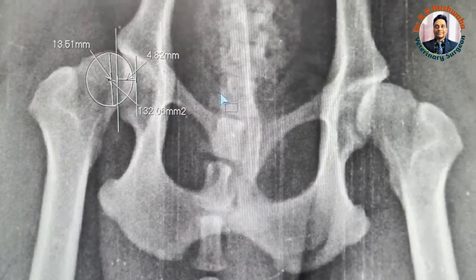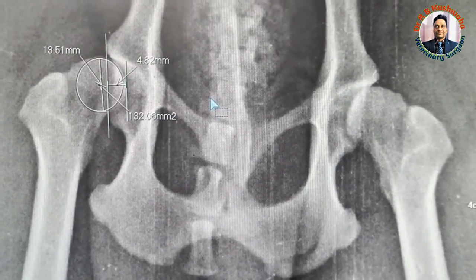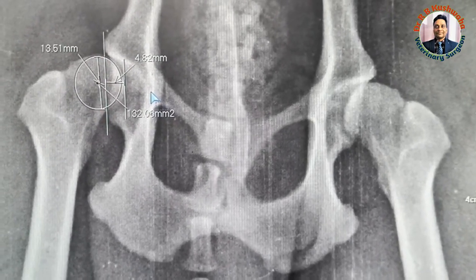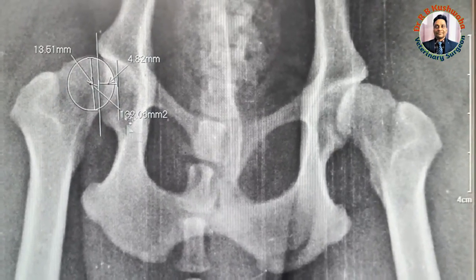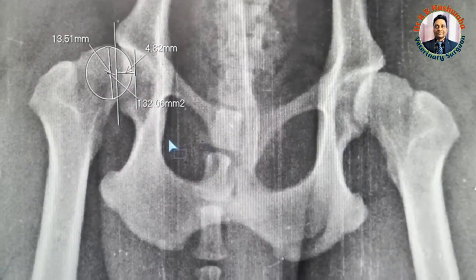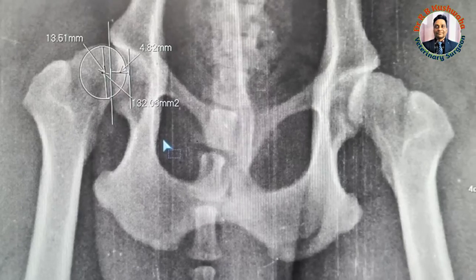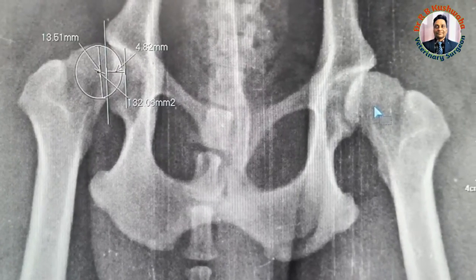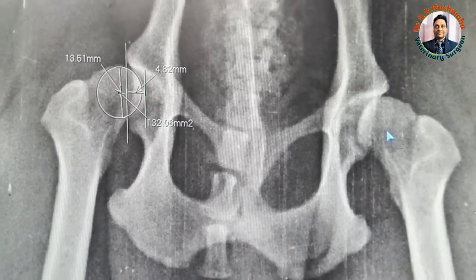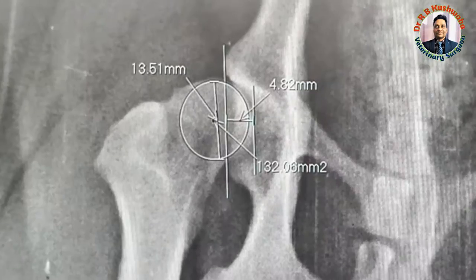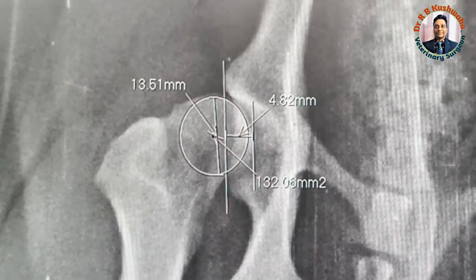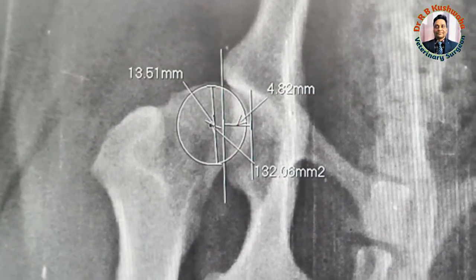Normally, 60% of the femoral head should be covered by the acetabular rim. In this particular case, femoral head coverage measurement indicates this case is positive for hip dysplasia. The radiographic features, as well as the clinical sign of bunny hopping gait, are also suggestive of hip dysplasia.